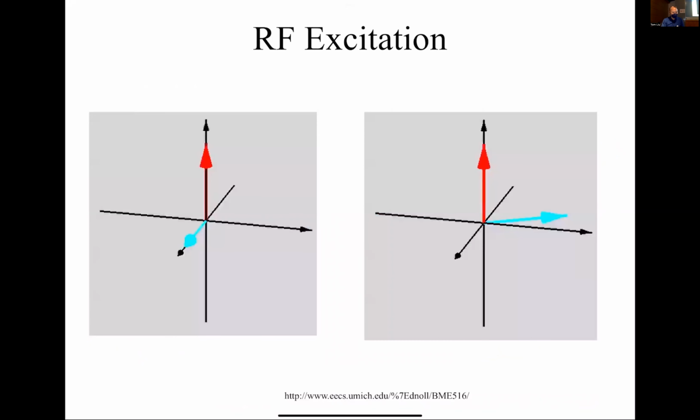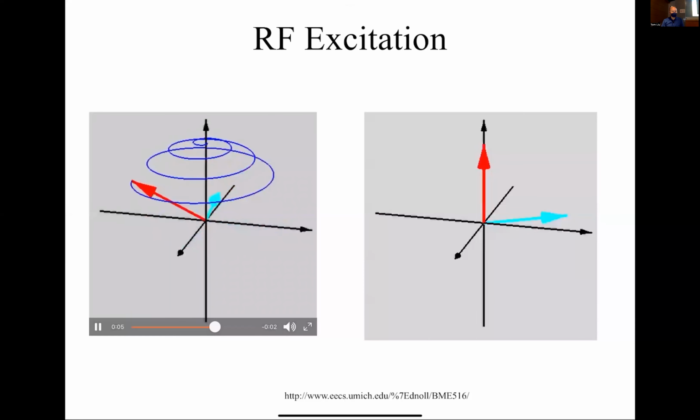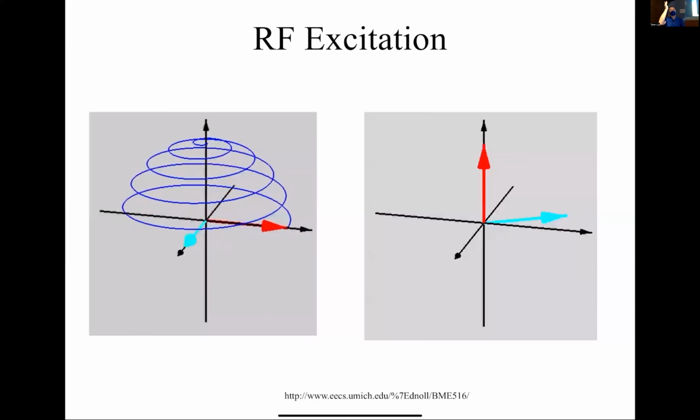Okay, so just to remind you, this is just another way of looking at it. In the red, you're going to see the magnetization, and in the blue, you're going to see the B1 field. And you see, if we're on resonance, then we are able to tip that magnetization away and spiral it down. For most things, the easiest thing is we assume we're just going to do a 90-degree flip angle. We just tipped it 90 degrees. And if we are not at the right resonance, then it's like you're running along the merry-go-round at the wrong speed, and your force is just not useful. In fact, if you tug too hard, the string is going to break. So that's an analogy that you can keep in mind.